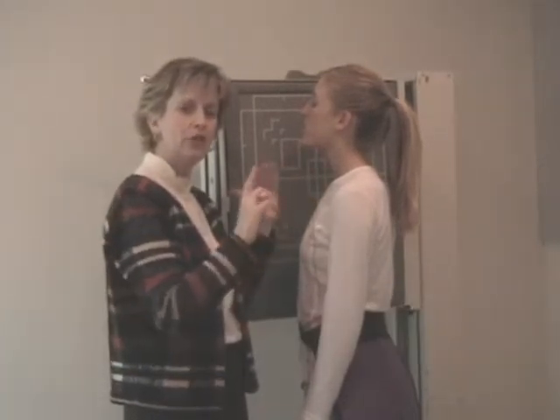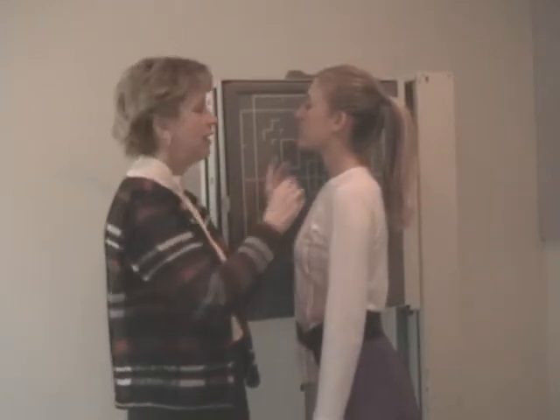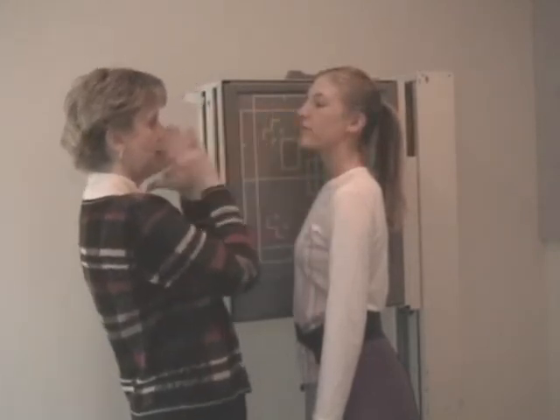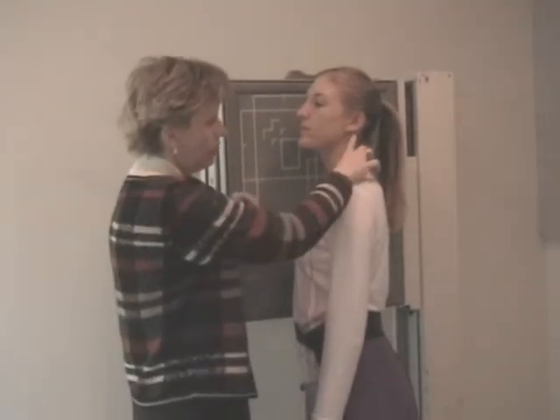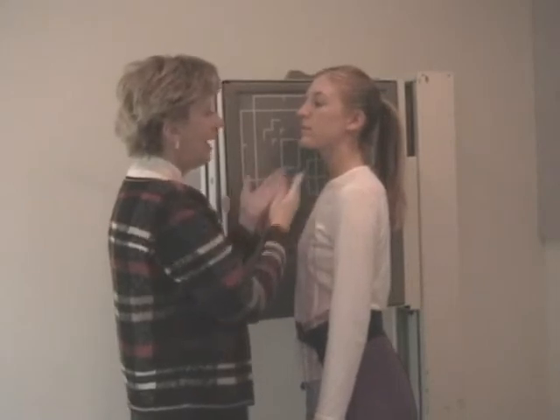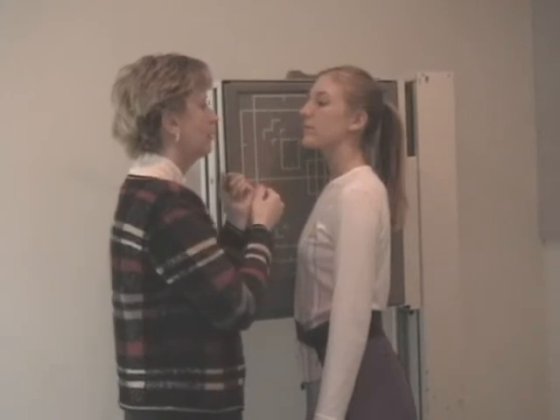So some techs choose to compromise the openness of the intervertebral foramina a little bit and turn the face into a lateral mode so the face is looking straight out at you. The disadvantage of this is they tend to close the first and second intervertebral foramina, but the advantage is that the mandible totally clears the spine.